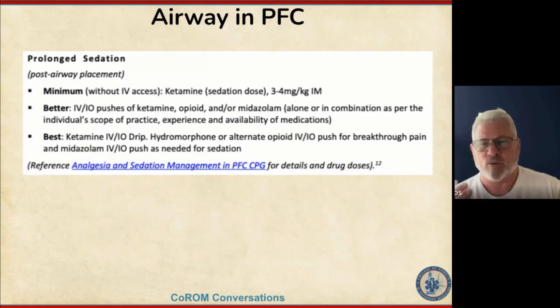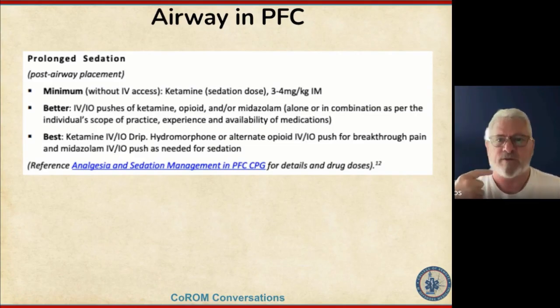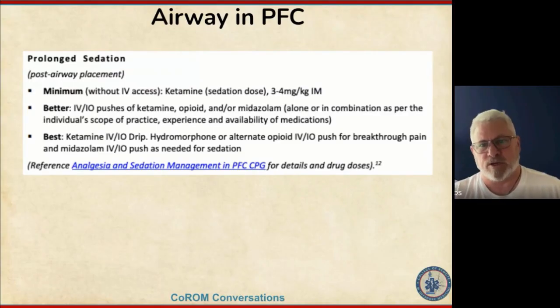It's the same reason why you have a PEEP on the end of your BVM. Once you overcome that initial resistance of the alveoli opening, the effort to put air through the airway is less because the PEEP is holding the alveoli open and you're correctly positioning your patient. So you're not having to overcome those obstacles from air that's outside the mouth to air that's inside the alveoli. That's the smoothest, least resistant path based on positioning, the PEEP valve use, and proper seal. All those things make the airway easier.